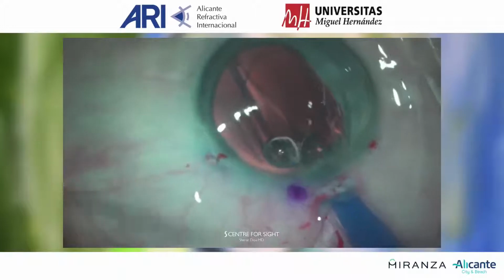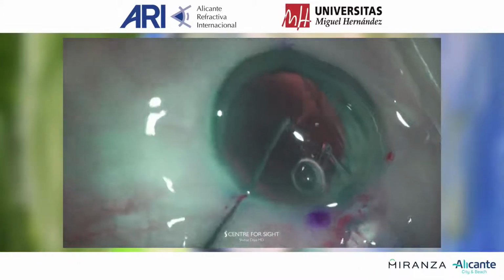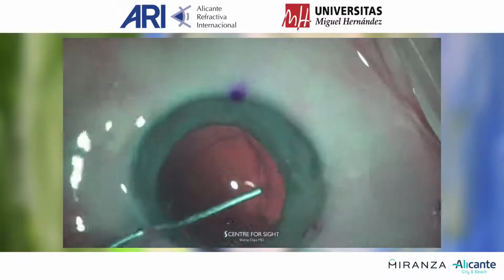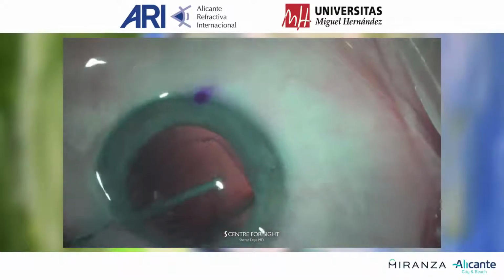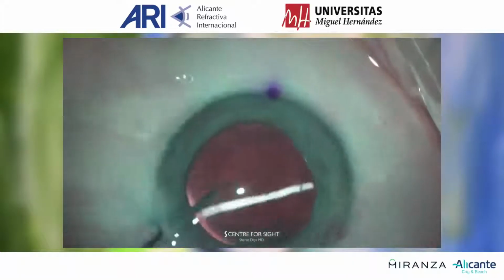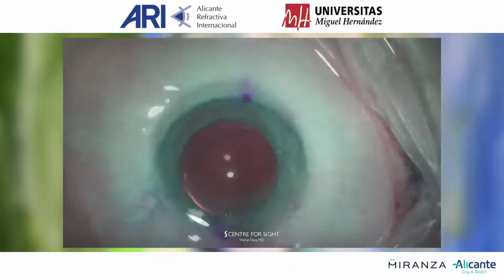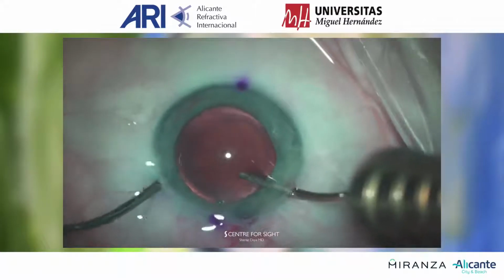This is a hydrophilic acrylic lens which has very good optical properties as the astigmatism is corrected by the lens in a bitoric fashion. There's the lens in the bag, and it will be aligned in the correct axis.